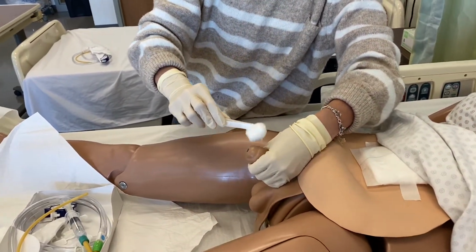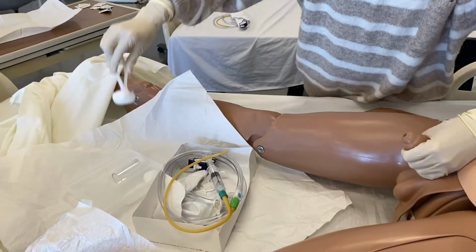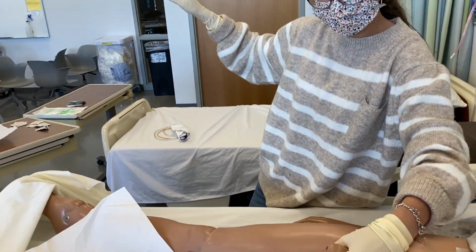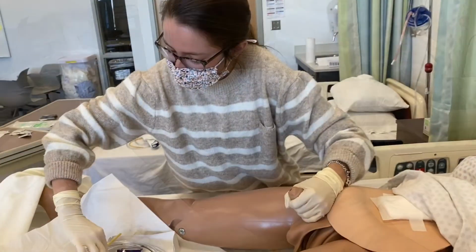Clean another circle. Discard my last cotton ball. This is my non-sterile hand, so I'm going to keep it positioned on here.